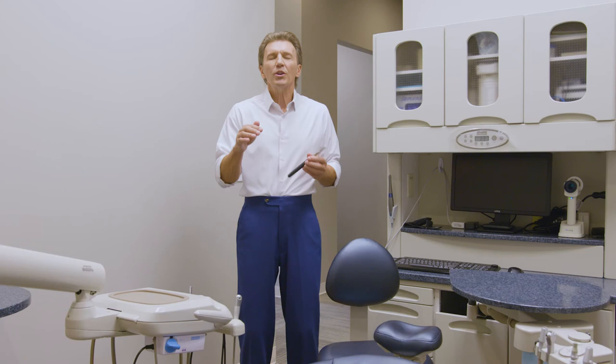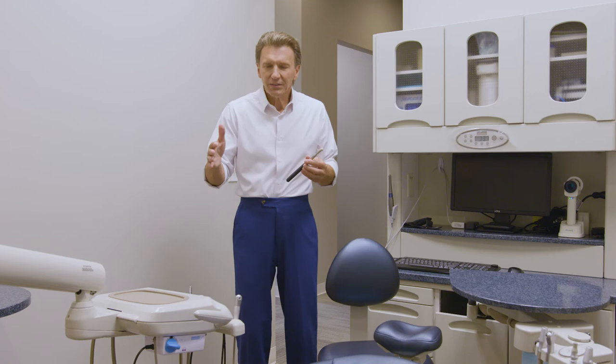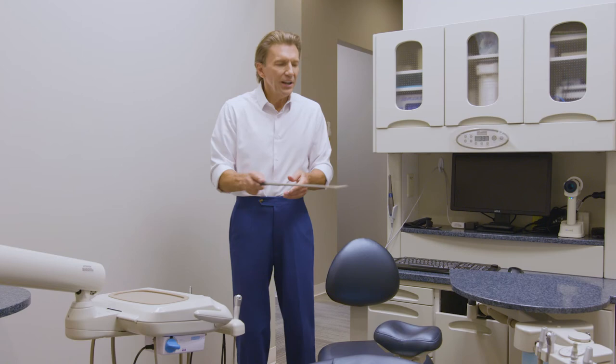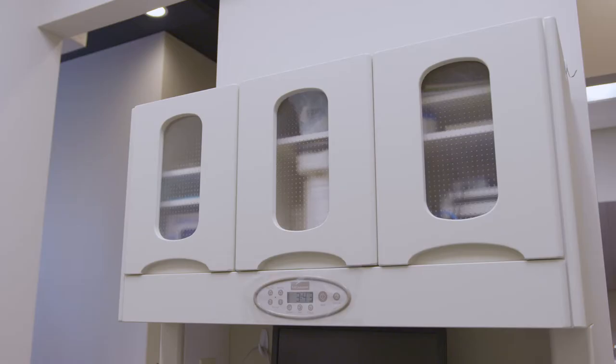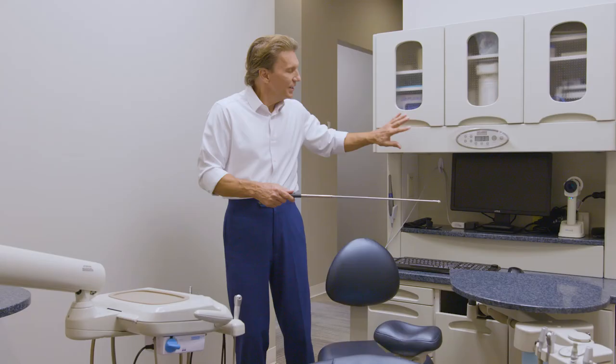In this operatory, we have what we call split delivery. The doctor or operator's module is split off from the assistance module. The doctor's module is chair-mounted, attached to the base of the dental patient chair. The assistance module is attached to a flexible 12 o'clock work surface, which is in turn mounted on a 12 o'clock cabinet. This happens to be the Midmark Synthesis series — a very durable unit with a steel substructure.